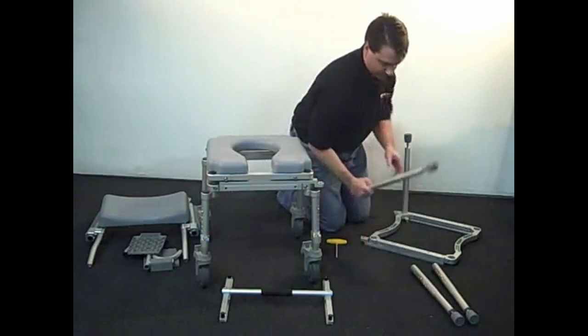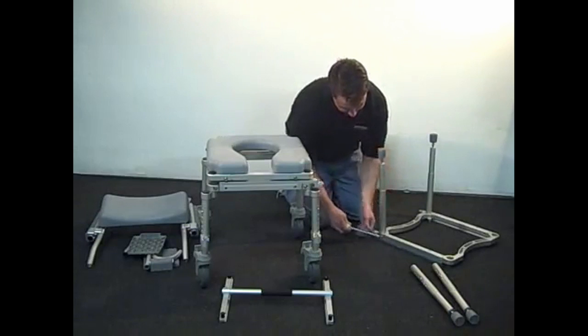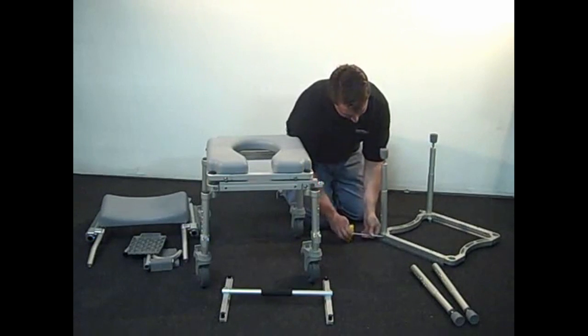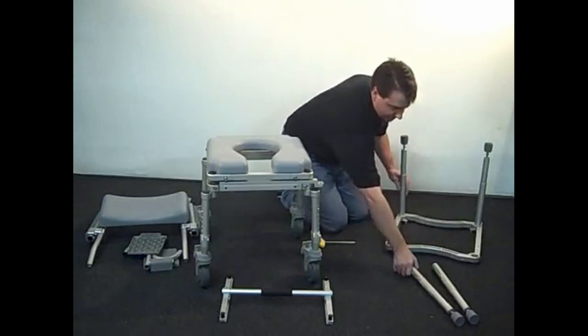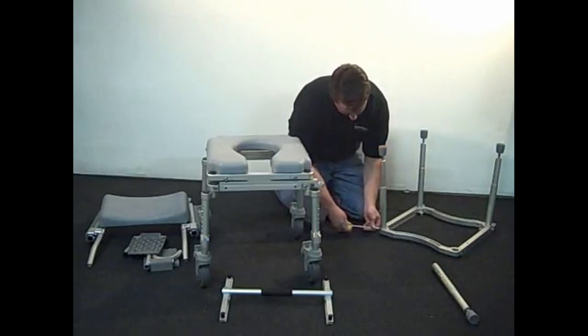Position the legs so that the adjustment holes are facing outwards, allowing for easy height adjustment in the future. Again, lock the legs into place by using the included T-handled Allen wrench to tighten the bolts located in the corner of the frame.